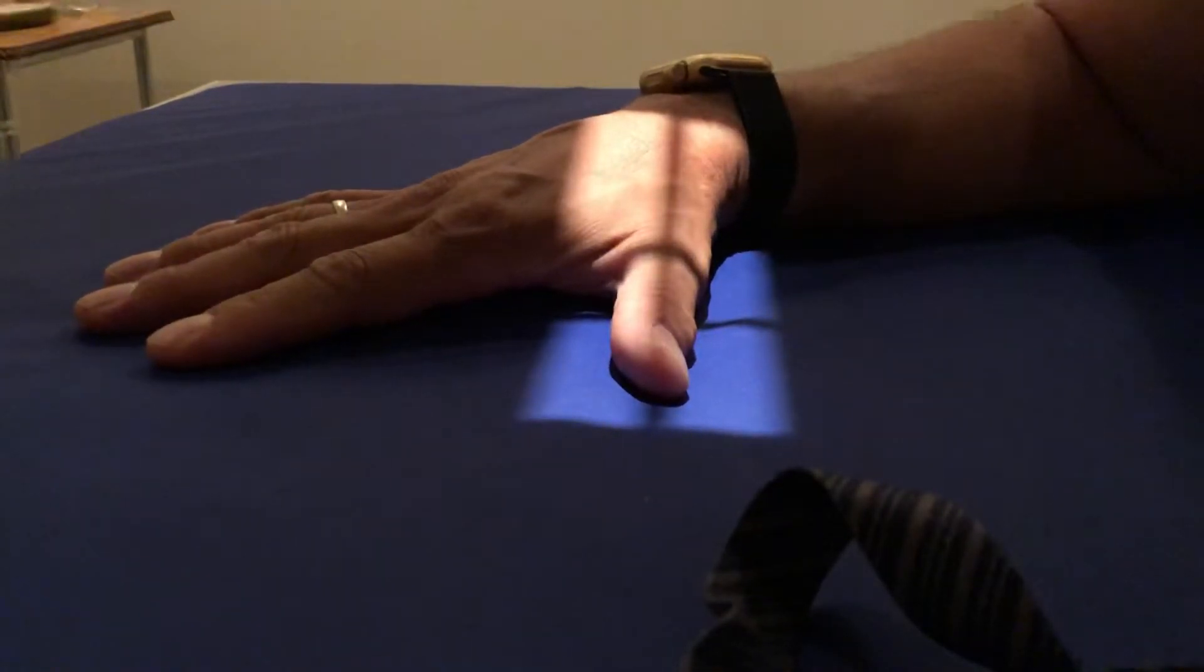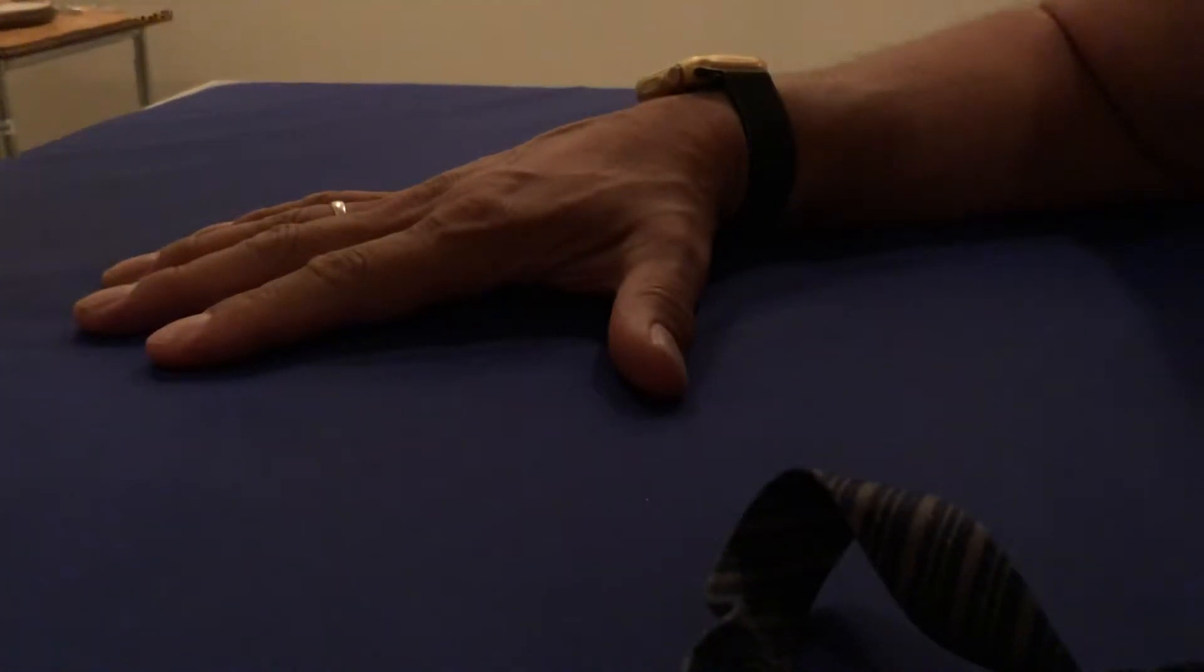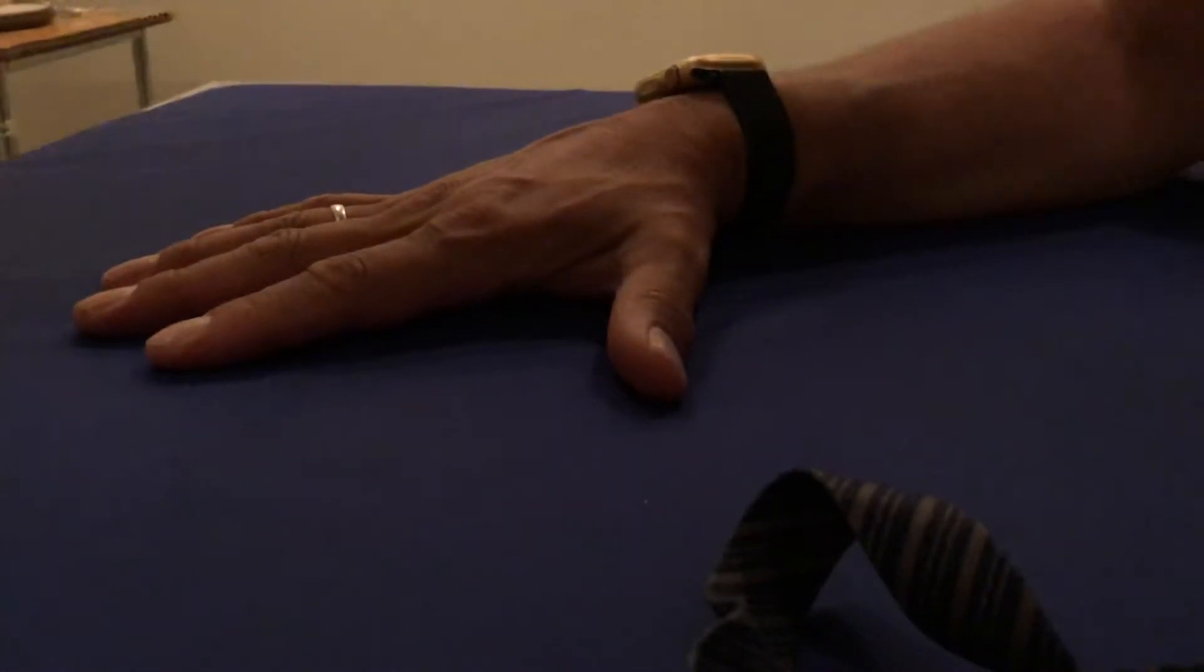So in this x-ray of a thumb, we're going to be doing four positions. It's going to be the oblique, the lateral, the AP or PA, and the opposite oblique. So I'll show you how to do all four.